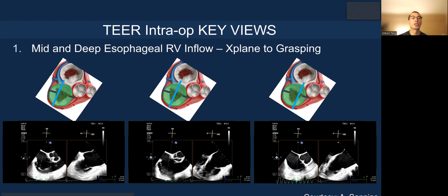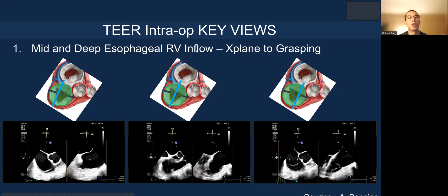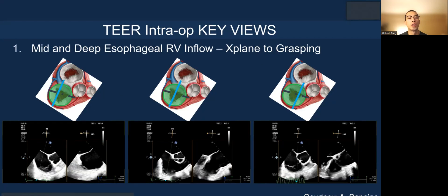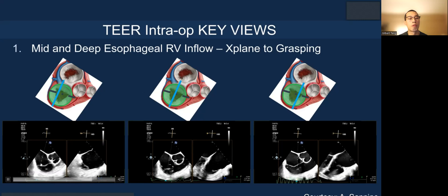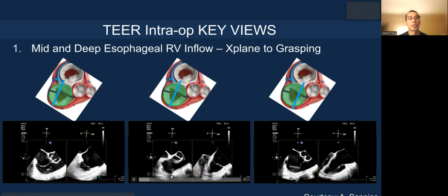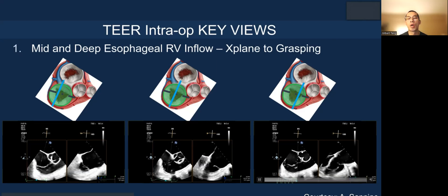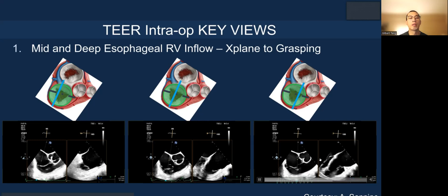The key views include mid- and deep esophageal RV inflow and X-plane grasping view. This is more posterior septal here because it's closer to the RV free wall. This is the mid-portion of the tricuspid, more central, posterior septal. And then more anterior septal, which is mid-segment, closer to the aortic valve, also known as the septum.